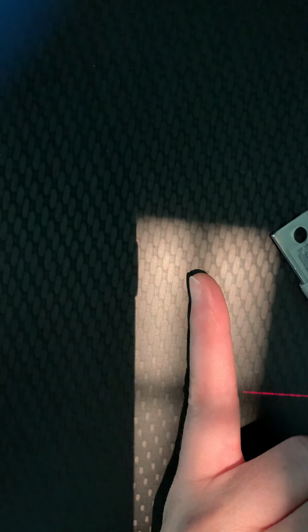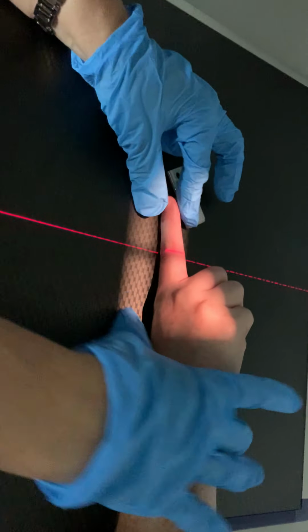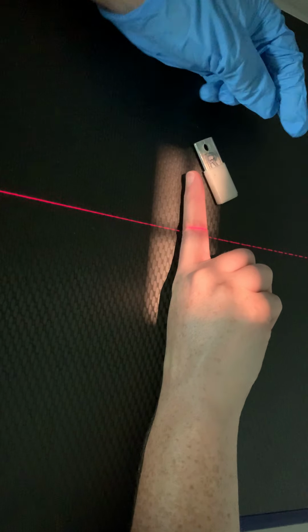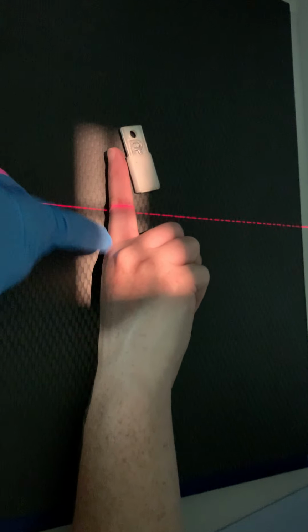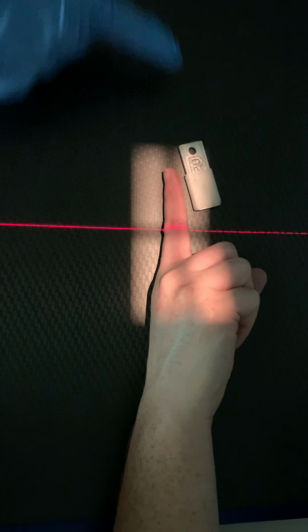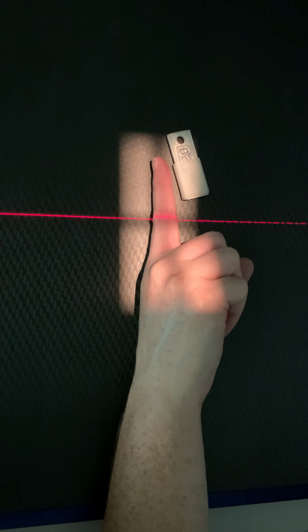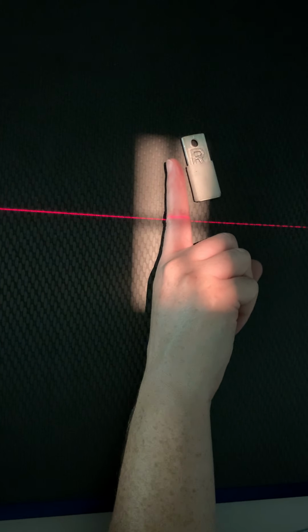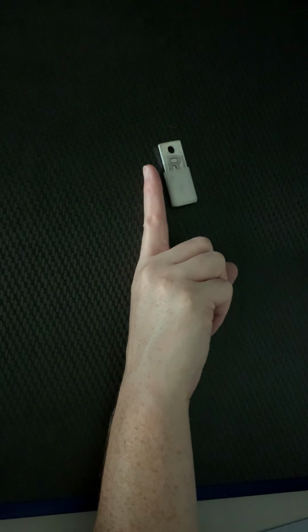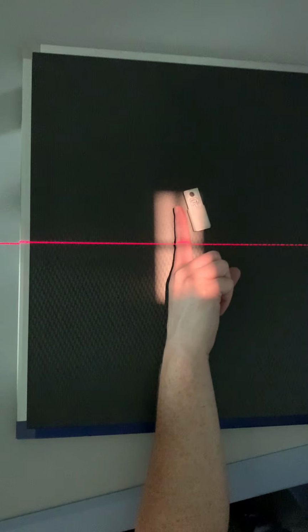Over it, so it's not gonna be as easy to see. There you go. And then we just move it over just a bit to be in the central ray, coming down the long axis. Collimation's coming 1 inch past the metacarpophalangeal joint, 1 inch past the end, and we're at the proximal interphalangeal joint. So that's lateral finger. Always shield your patient, 40-inch SID. And center tube, part, and IR, just like we always do.